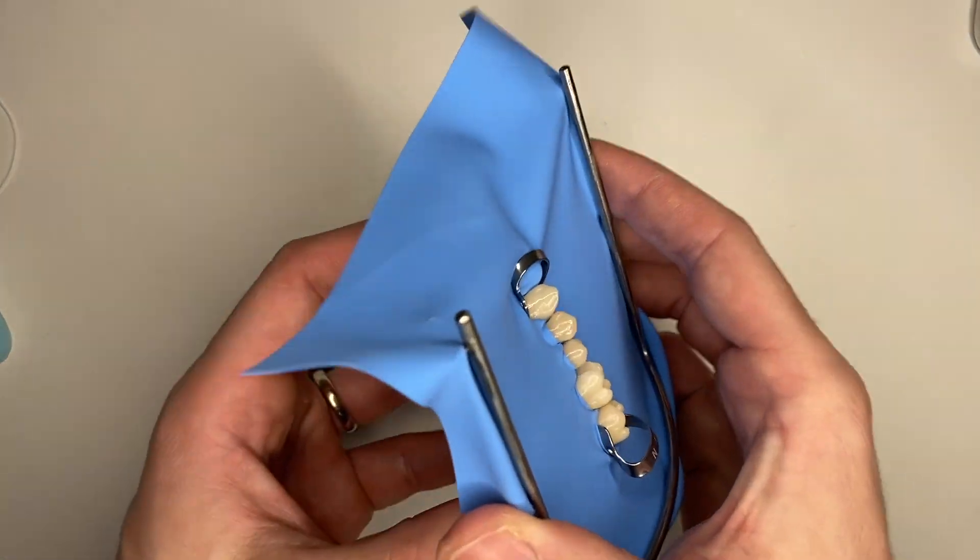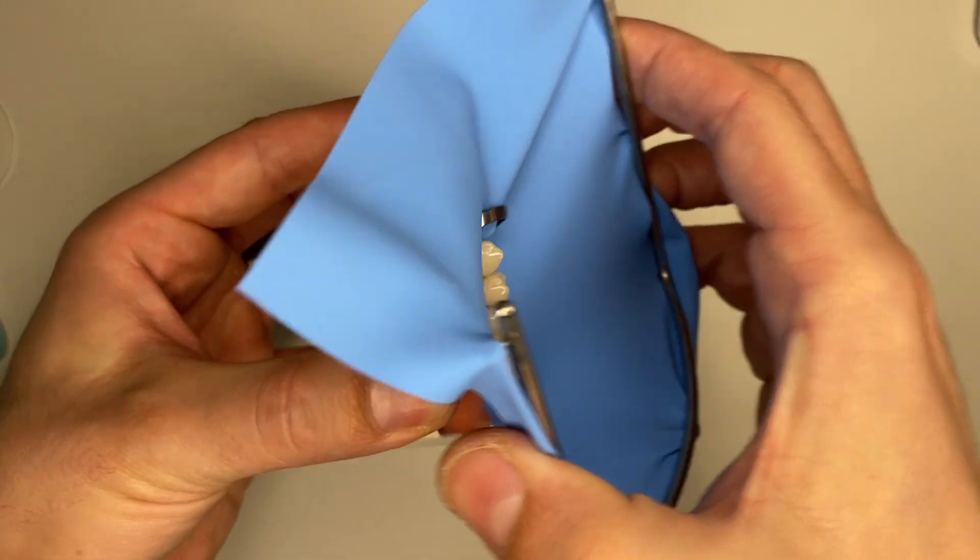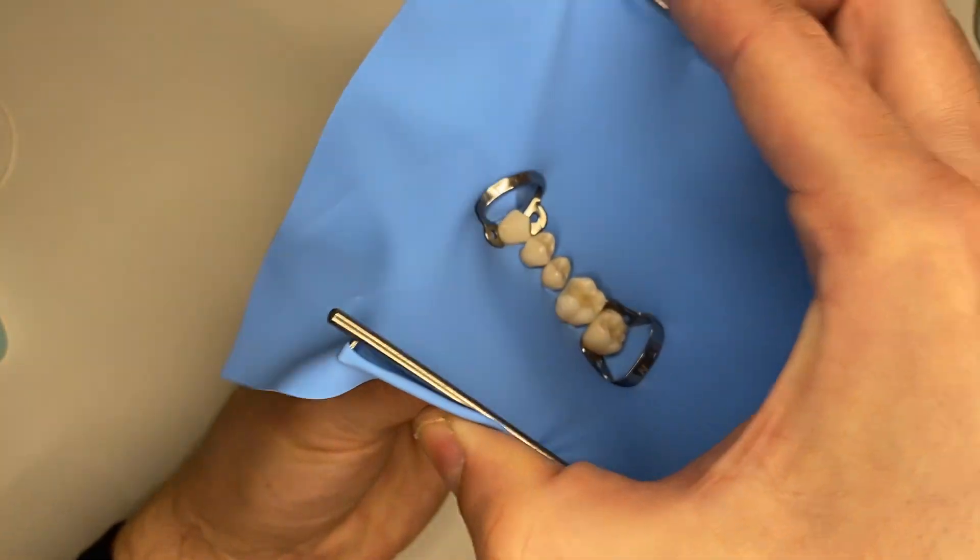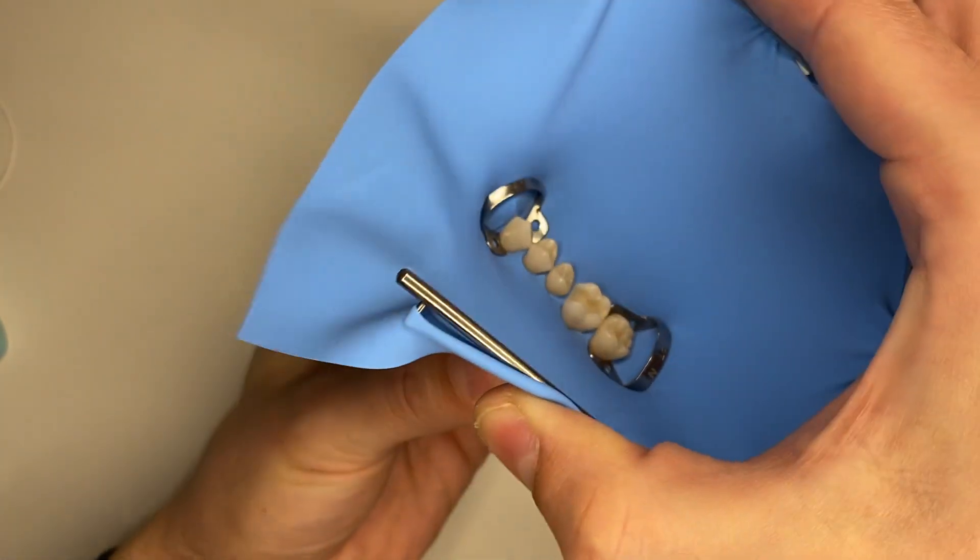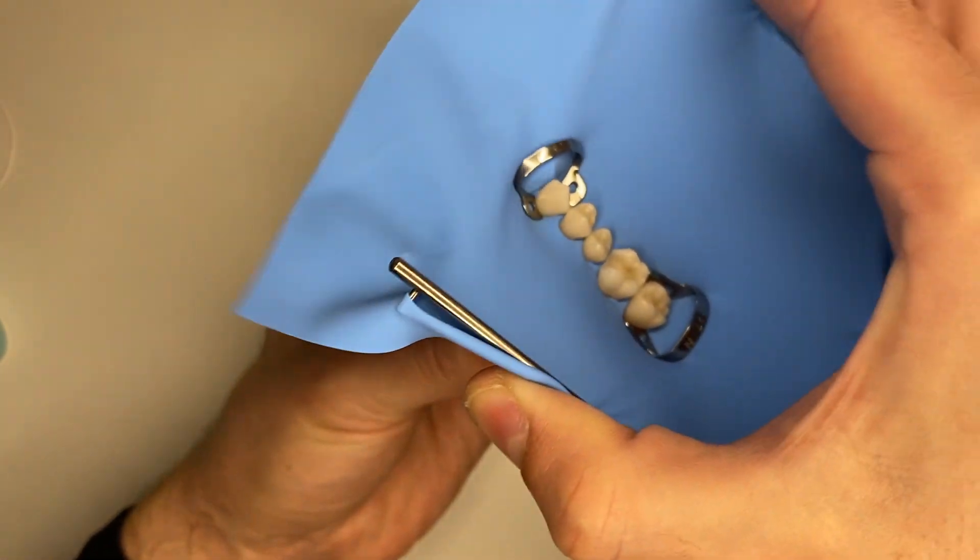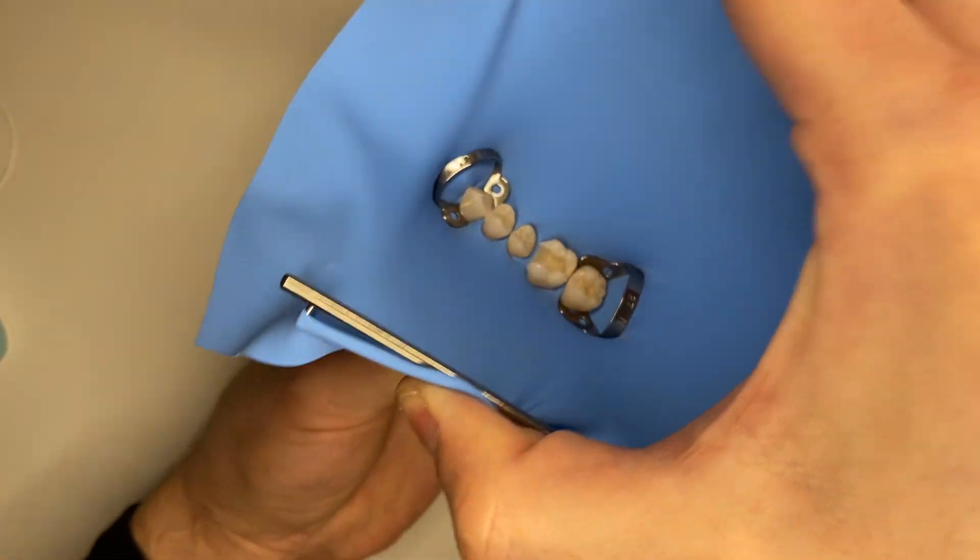This is going to be quite stable. As you can see, I'm not able to pull it off. I'm not sure any of your patients can exert this much force on your rubber dam. It's not going to give away.